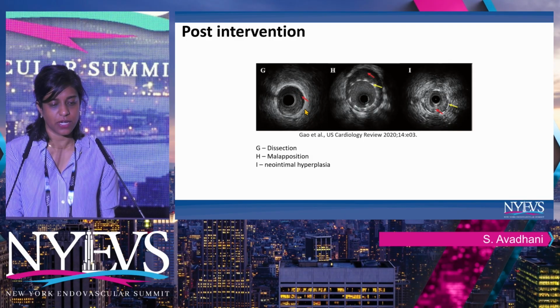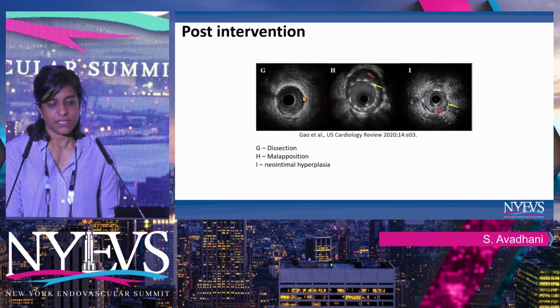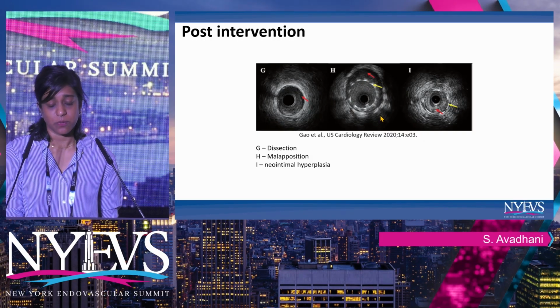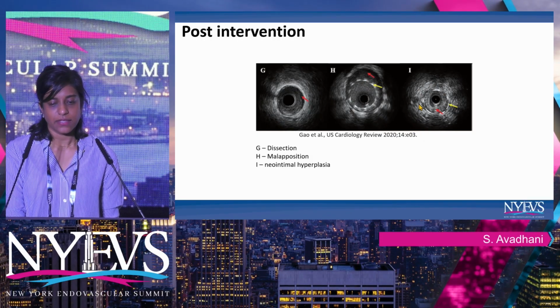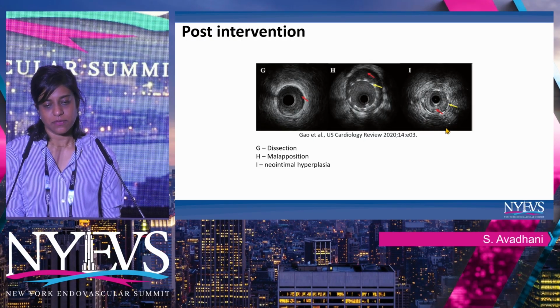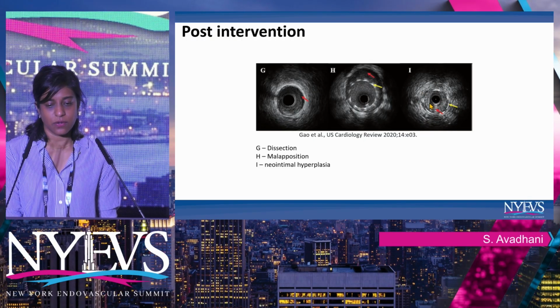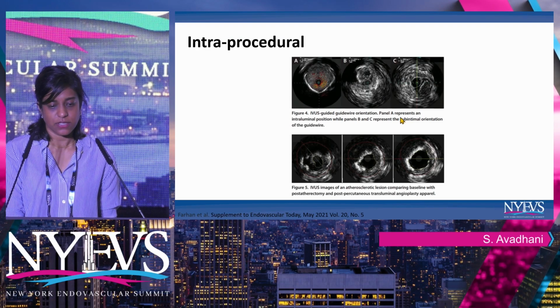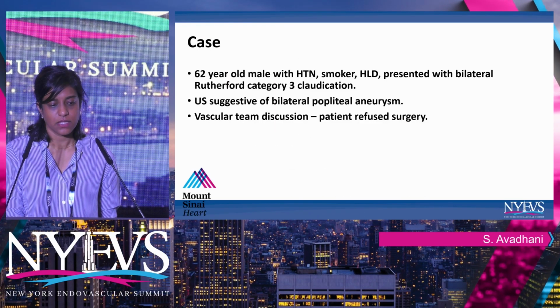In this picture, you see a small dissection and malapposition of the stent in this case, which might need more post-dilation. And this here shows you an image of a mechanism of stent failure or restenosis, in which case there is a lot of neointimal hyperplasia.